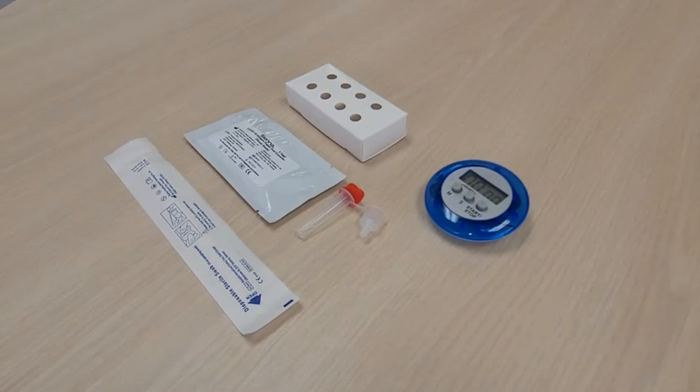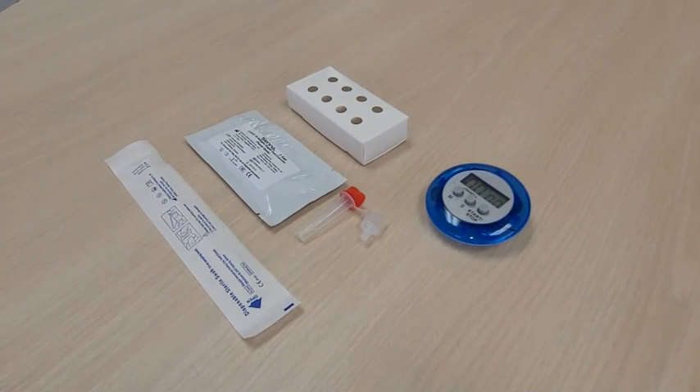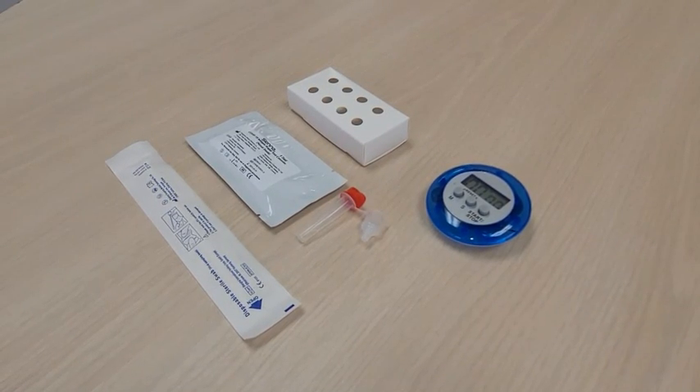Do not remove the test cassette from the foil pouch until you are ready to perform the test. The nasal pharyngeal swab is provided with the test kit. Do not remove the swab from the bag until you are ready to collect the sample.